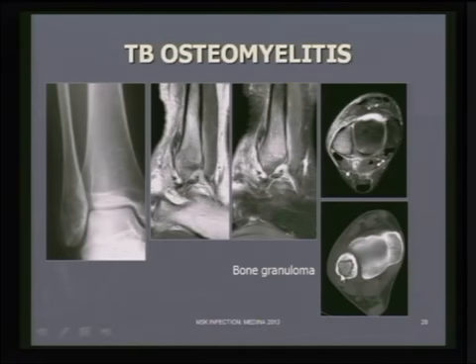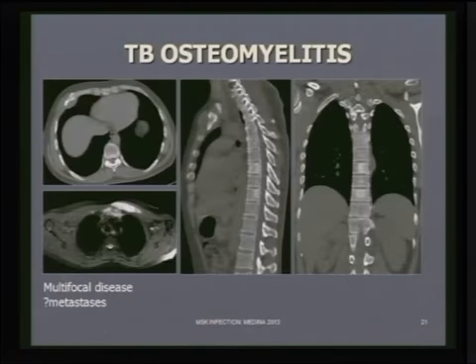And this is an example of a TB granuloma within bone. This was biopsy-proven tuberculosis. The second point I want to make about TB is the relative frequency with which it presents as multifocal disease. And I'm going to show you a couple of cases.